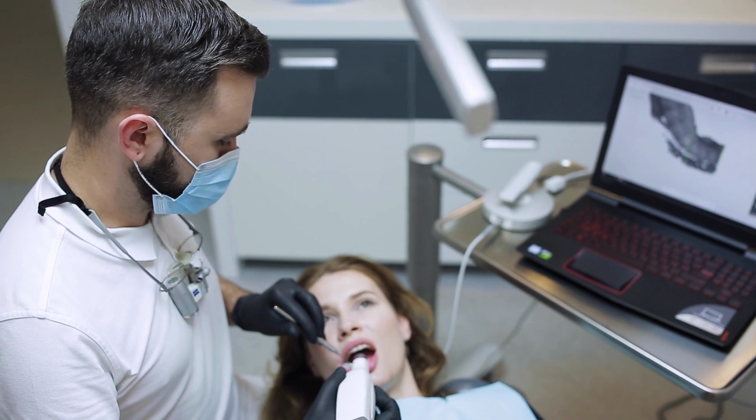First, when we have the ability to scan your teeth, when you come back in a year, by the way, we can scan them again and see, as a wellness check, have your teeth changed. So if you're someone that thinks you're clenching or grinding, but you're not certain, we can do a very quick three-dimensional scan of your teeth when you first come in, and maybe a year or 18 months later, and actually measure in microns or portions of millimeters how much tooth structure has been worn away. And that's important because you should only lose 1 millimeter of tooth structure in 100 years. Otherwise, something is wrong. So that's just one little way.